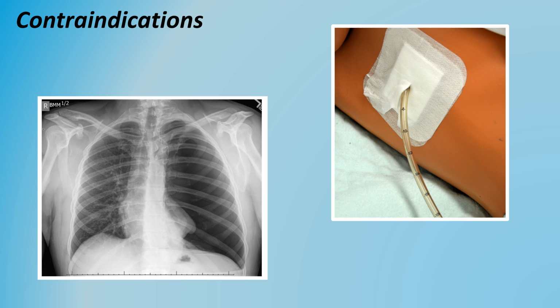Let's think about the physiology of a pneumothorax, whether it be traumatic, medical, or idiopathic in nature. Regardless of the cause, this patient now has air in the pleural cavity, causing increased intrathoracic pressure. CPAP also causes increased thoracic pressure, and depending on the cause, can introduce even more air into the pleural cavity, leading to faster deterioration of these patients. Ultimately, these patients need supportive care until they can receive a needle decompression and chest tube.